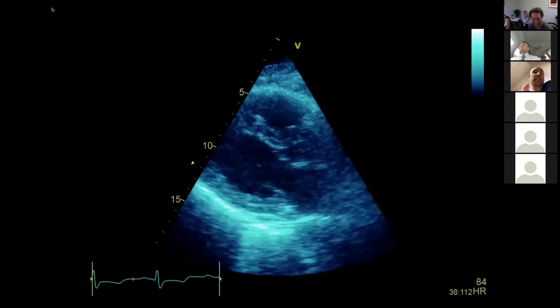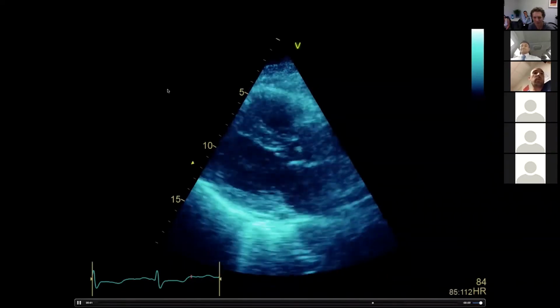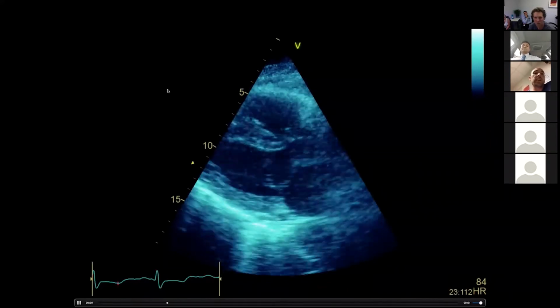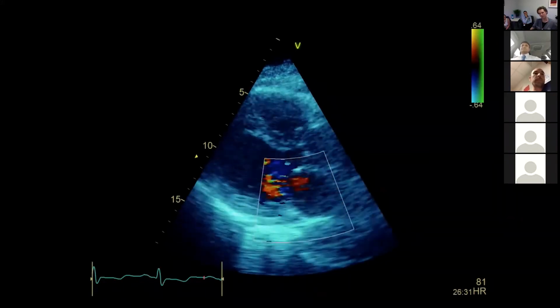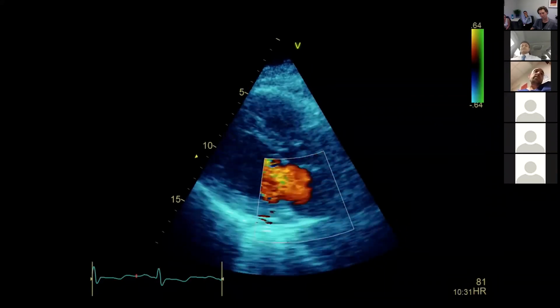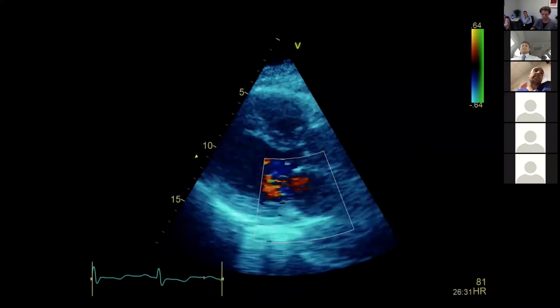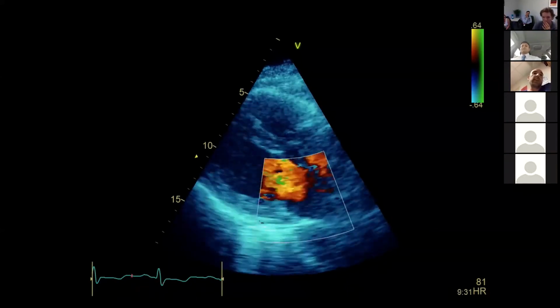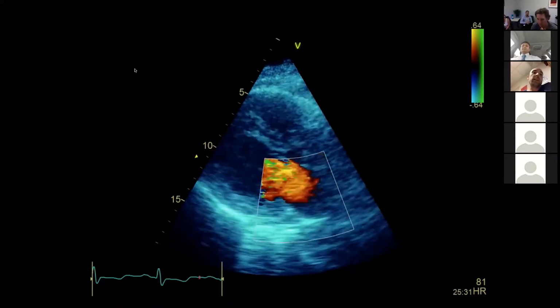I think I can see some thickening there, so I'm going to call it hypokinetic. Sweet. And then the anteroseptal wall is moving, but it's a bit hard to know whether that's translational movement or thickening. Yeah, fair enough. It's good thickening. And there is posteriorly directed MR that, just on the basis of the vena contracta, looks like it's probably severe with a significant amount of flow acceleration that's wall hugging. Beautiful.